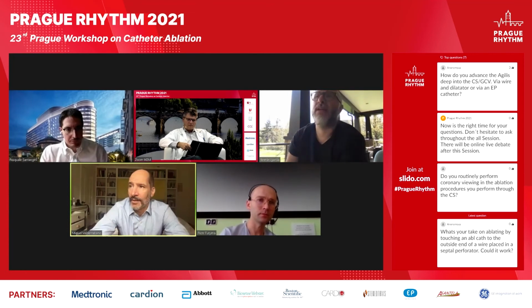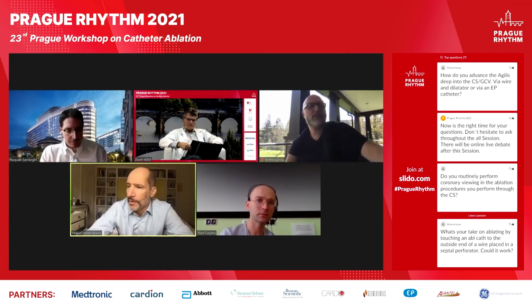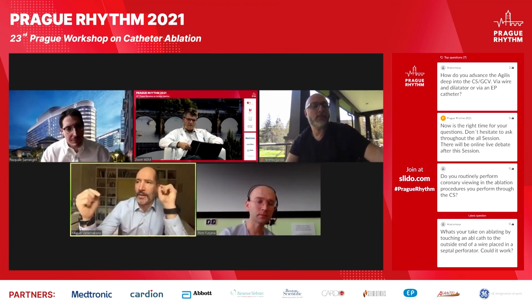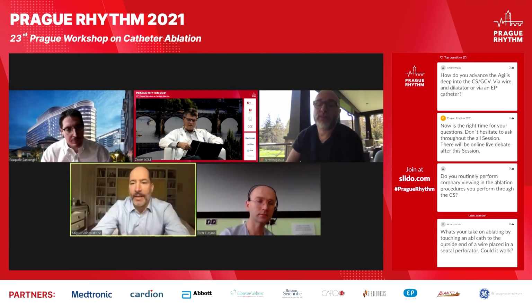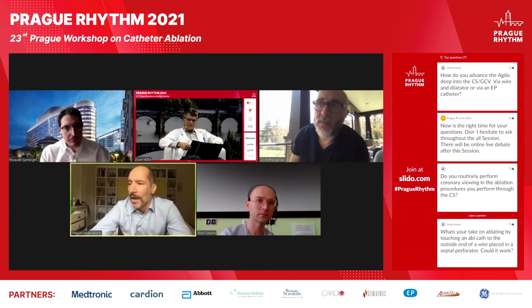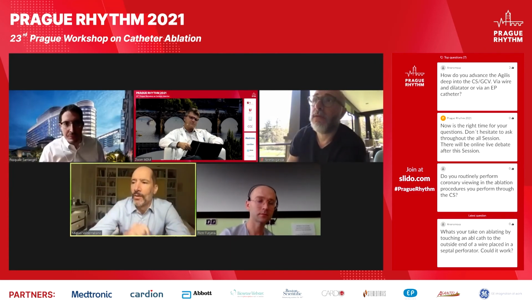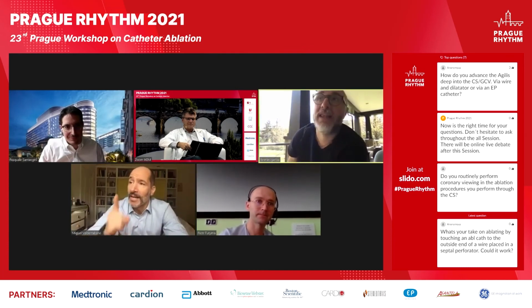I disagree with that. Let me ask you, you have an assumption there that ablation by crossfire from RV and LV and AIV is a small lesion. So I would challenge you to show me data on the size of ablation by alcohol compared to the size of ablation by multiple site radiofrequency. You don't have the data.